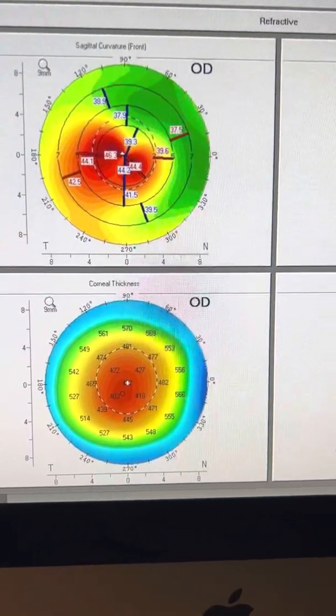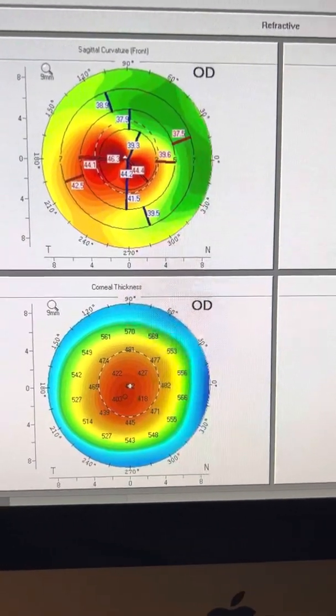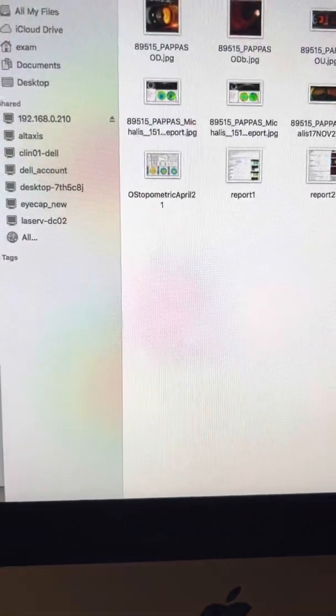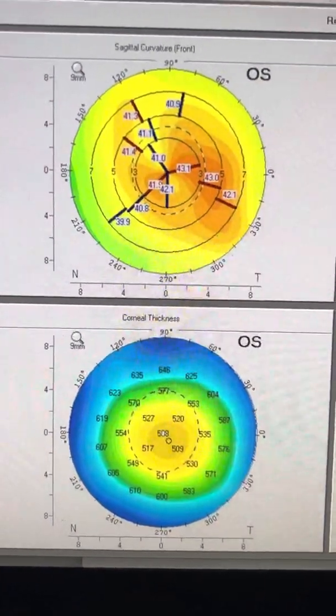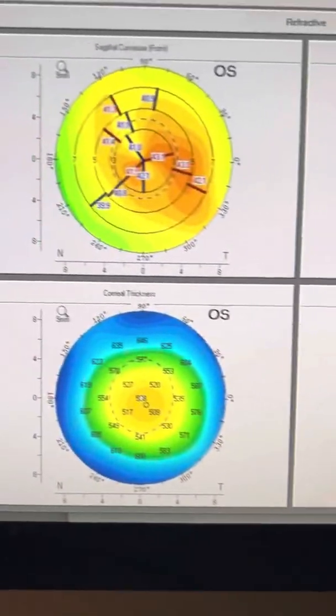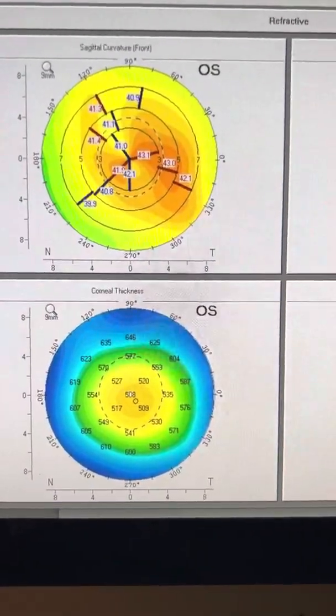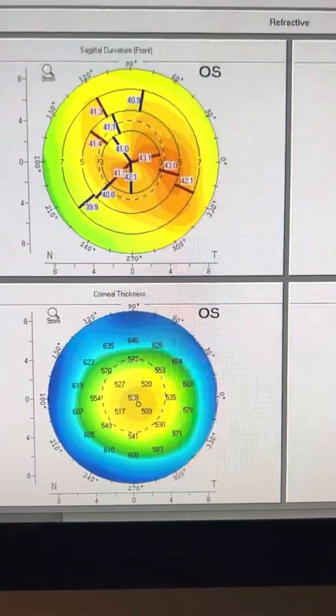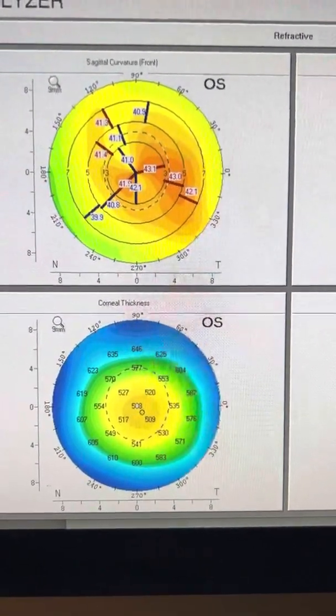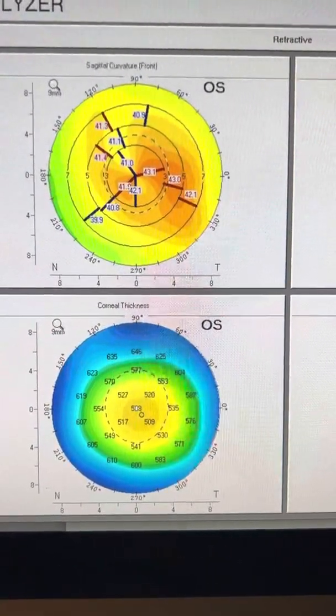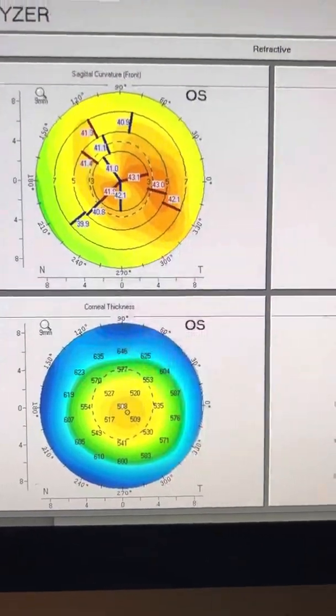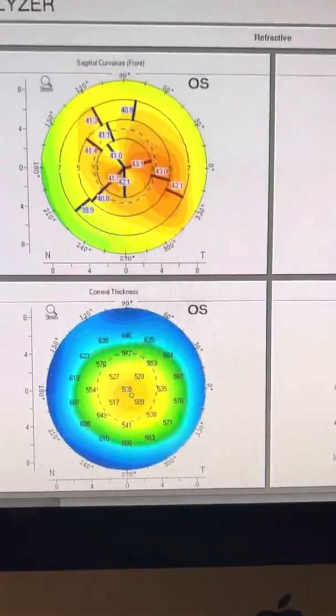And of course, follow left eye closely for any changes. But at 17 and with the Pentacam maps that we see here, I would not recommend prophylactic cross-linking here because the patient is an uncorrected 20/20, and we may make the vision worse.